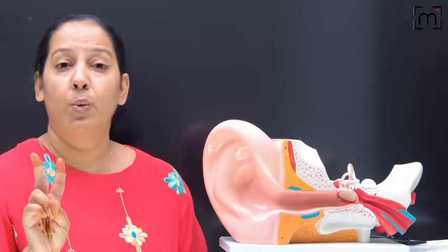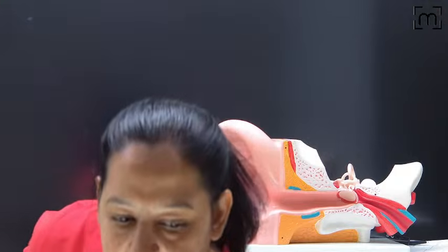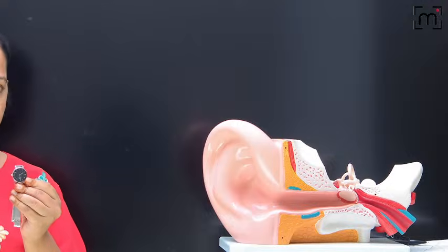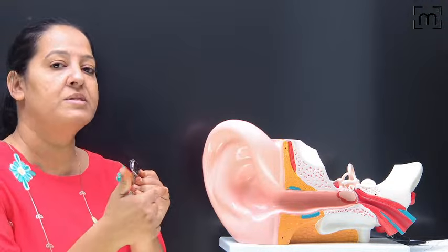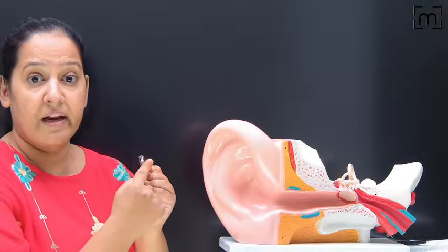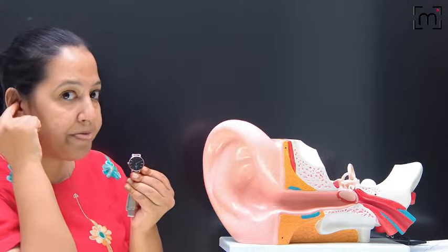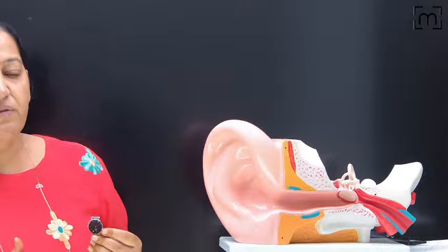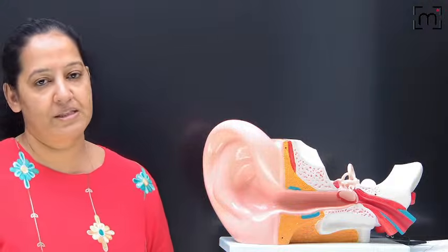The second test we are performing here is the watch test. I have a clicking watch. Here is my clicking watch. I will keep it at a distance and ask the patient whether they can hear it. The patient says no. So I keep decreasing the distance, asking the patient to tell me the moment they start hearing. The patient says, yes, I can hear the clicking. So I will note this distance, from the pinna and EAC to the watch. Based on this, again an obsolete test of historical importance, I can tell whether the patient has mild, moderate, severe or profound deafness.